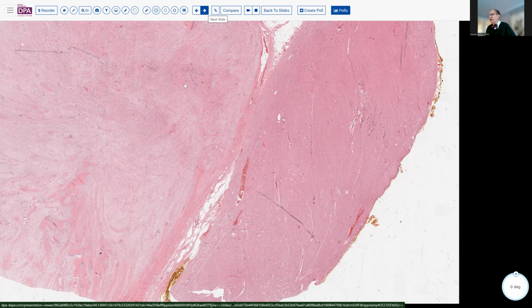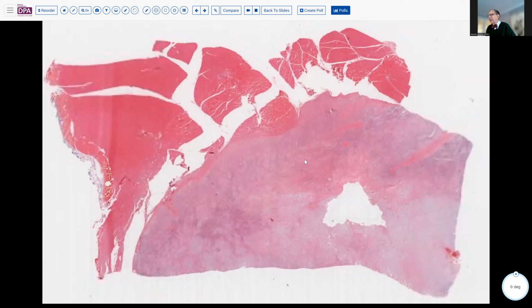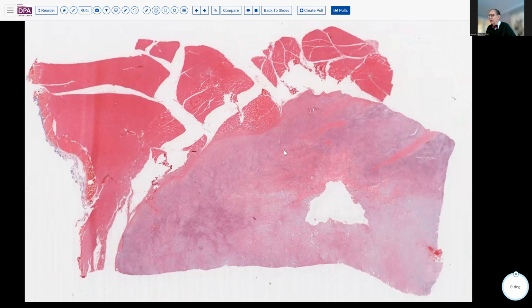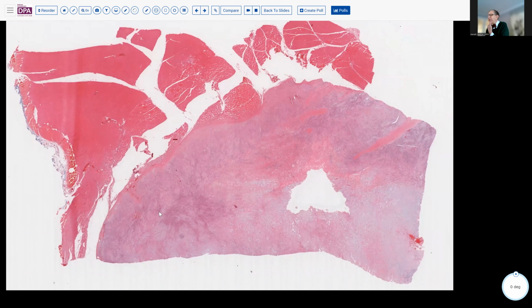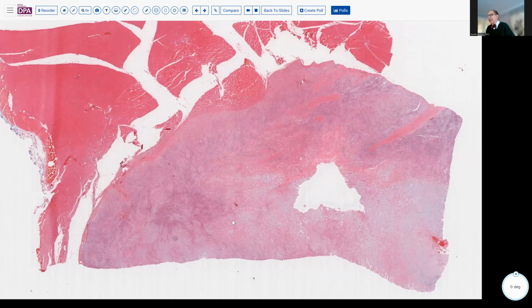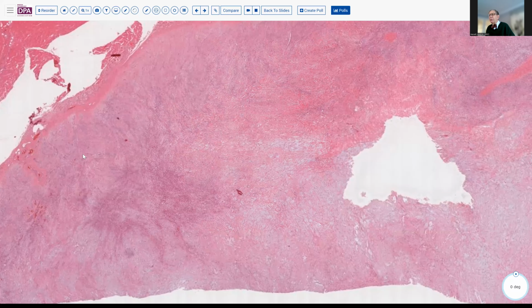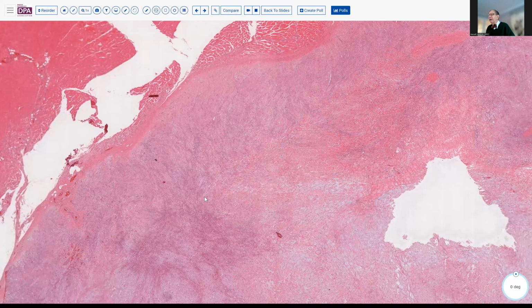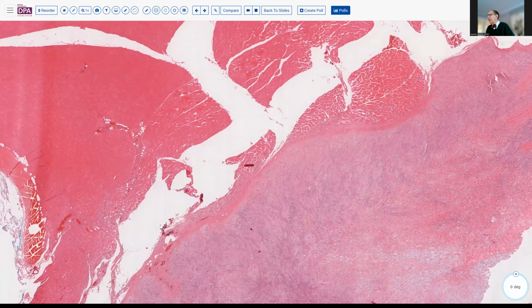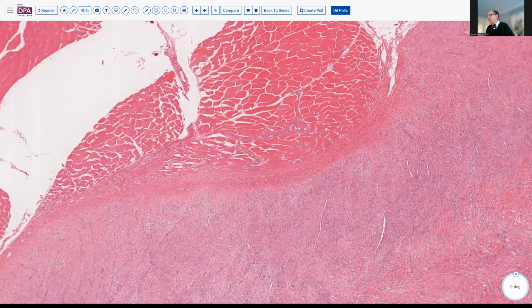Okay, well, another lesion that's kind of in the differential is this lesion. This was a 60-year-old who developed a mass lesion in the neck. And so, we see some degree of circumscription here, sort of right on the fascia, and here abutting some of the skeletal muscle. So it was getting quite large, and so it led to resection rather than biopsy.